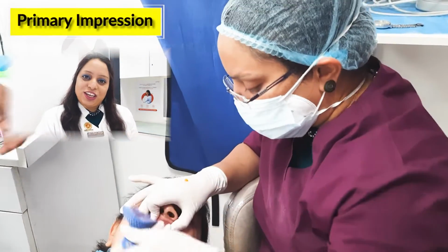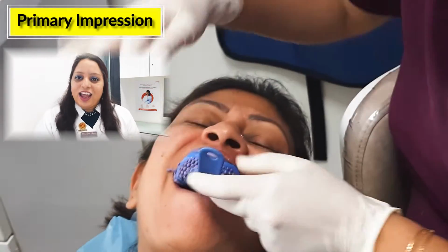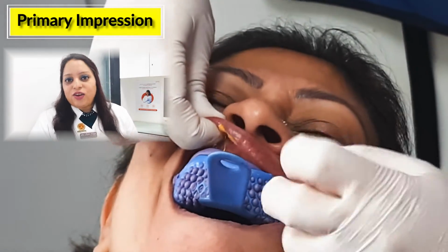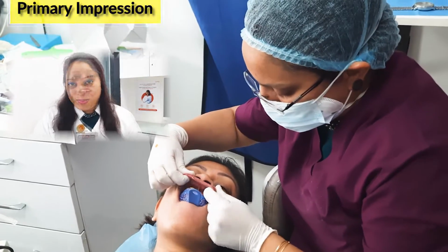What you see on the screen is the impression being taken. This impression is very important. It acts as a reference point and all the corrections are planned on this. How? We will see in the next step.